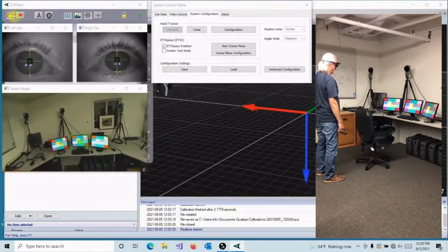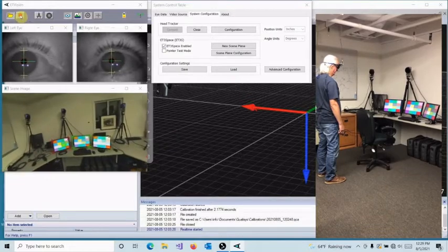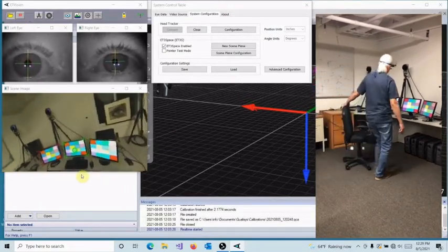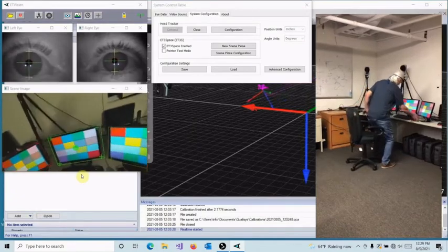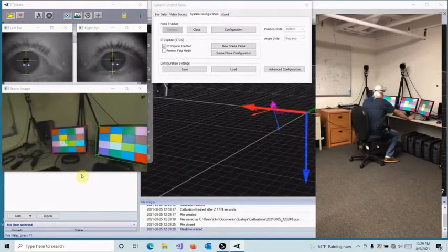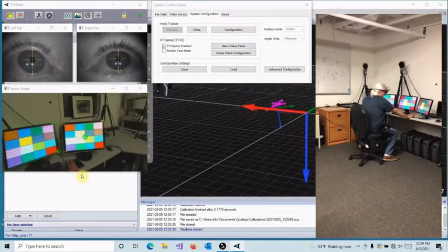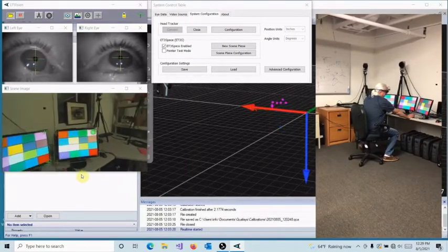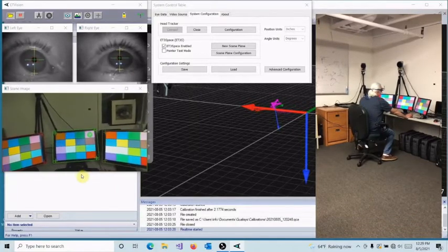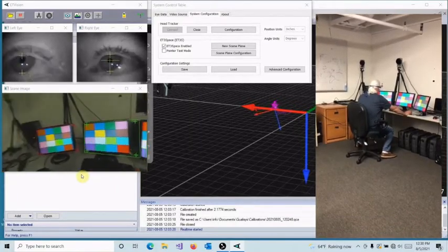In the scene camera view of the ET Vision, we can observe the gaze represented by the green circular cursor. We may also see the surfaces of interest that are shown with bounding boxes around each surface. Gaze is reported by recording the surface on which the gaze falls and the gaze position in centimeters or inches upon that surface.